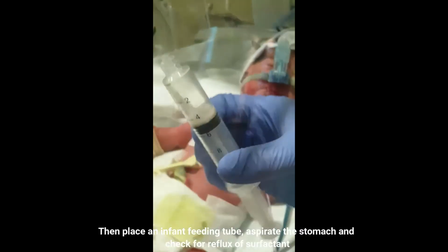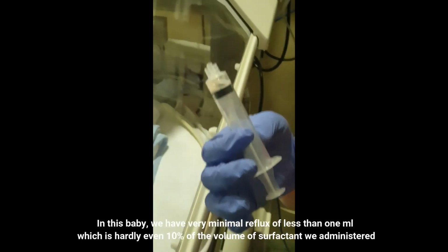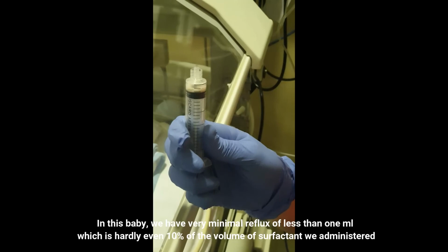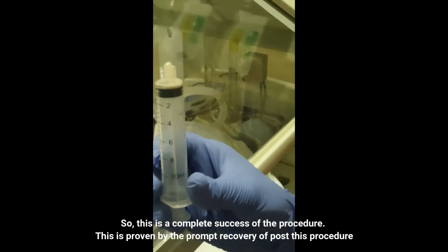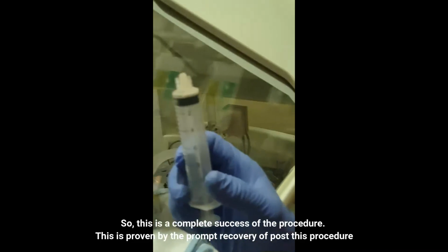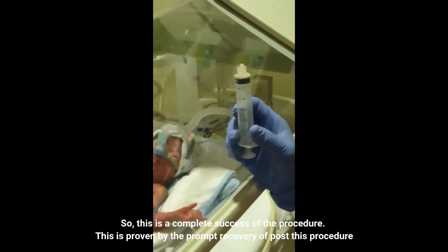And then we pass the infant feeding tube, aspirate the stomach and check for the reflux percentage of the surfactant. In this particular baby, you can see we have only very minimal reflux, which is less than 1 ml, which is hardly even 10% of the volume of the surfactant we administered. So in this, we have achieved a complete success of this procedure. This was subsequently proven by the prompt recovery of this baby post this procedure. The baby came off oxygen within 18 hours of administering Curosurf.